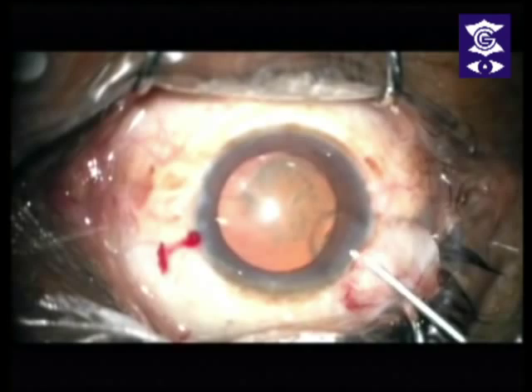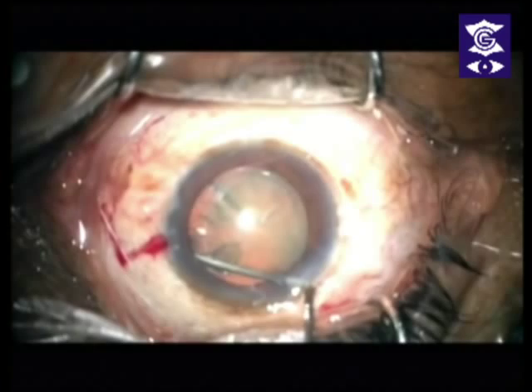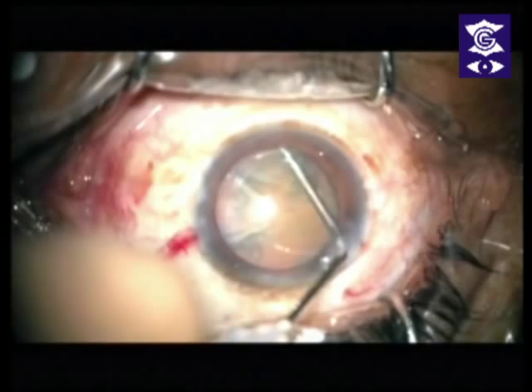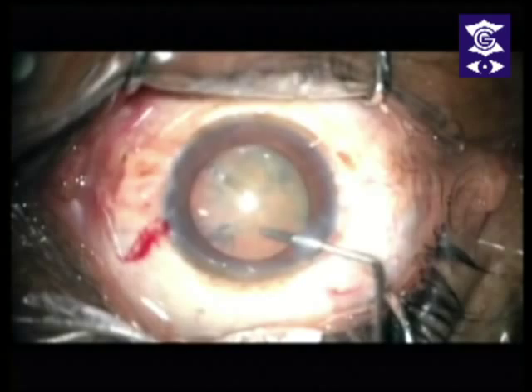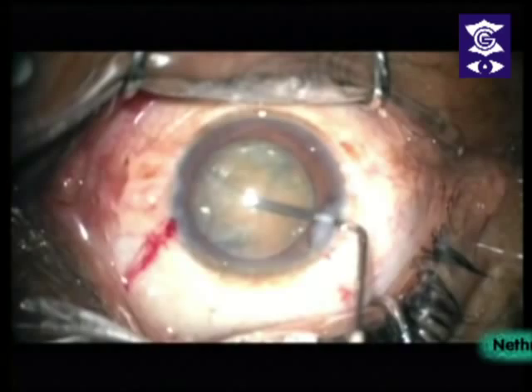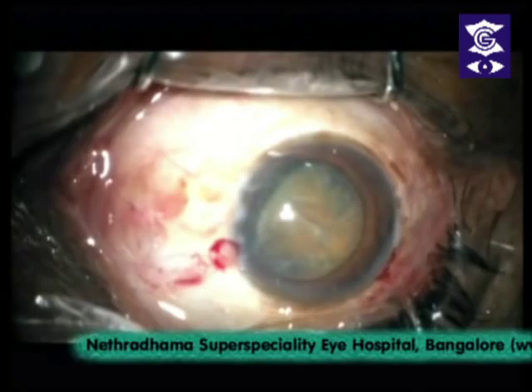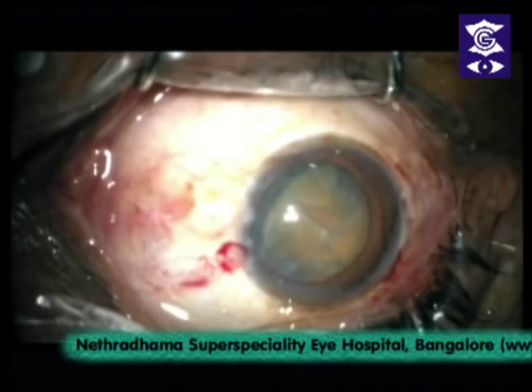Burp out some of the viscoelastic. I like to use viscoelastic from Zeiss — they have a dual system which has dispersive as the first part and cohesive as the second part. You can see the fluid wave going across. This hospital is equipped with Lumera microscopes, which don't really let you see how hard the cataract is, because even a hard cataract has a nice red glow. But it's visualization on a different level, and once you've used these Lumeras, you really don't want to go back to the old days. Now that I've tipped the nucleus up, you can see it's not as soft as we thought.